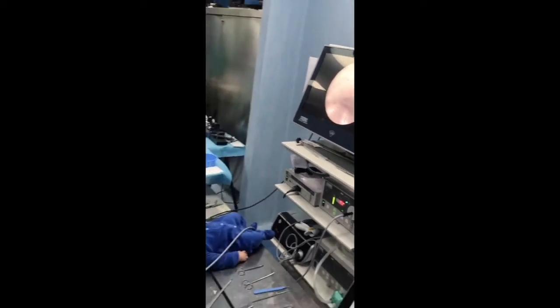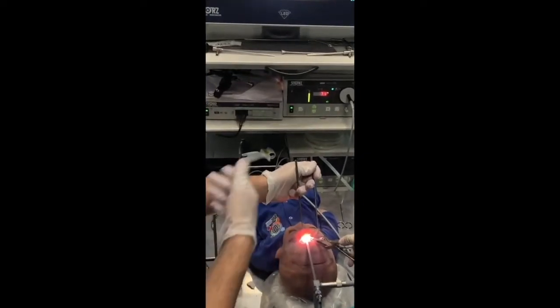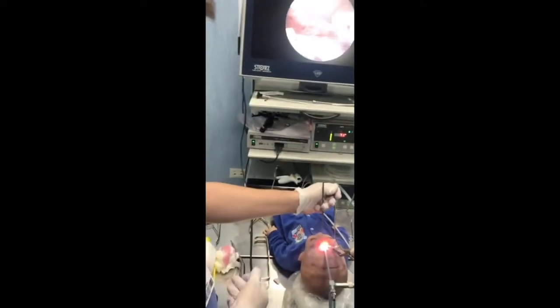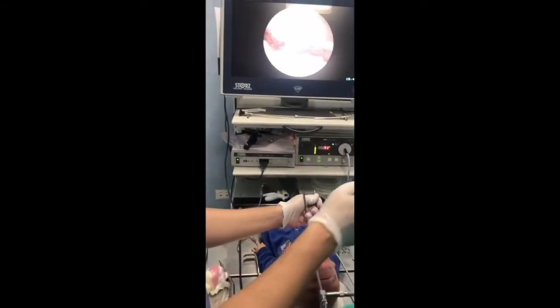Laboratory training is fundamental for acquiring familiarity with necessary techniques and skills to properly handle instruments. The main goal of this video is to present a novel simulator for the training of endoscopic treatment for scaphocephaly and trigonocephaly, covering all aspects of the procedure, from patient positioning to performing osteotomies.